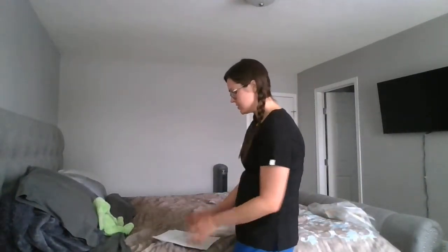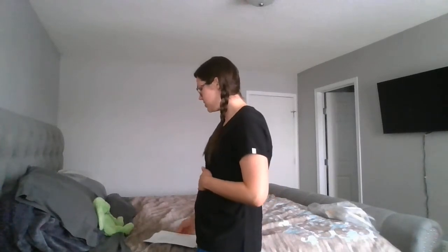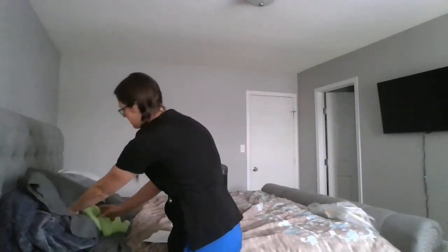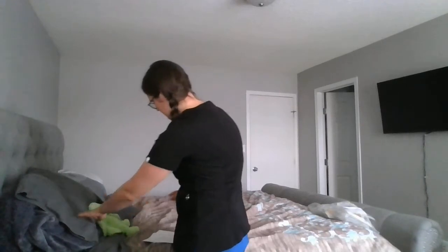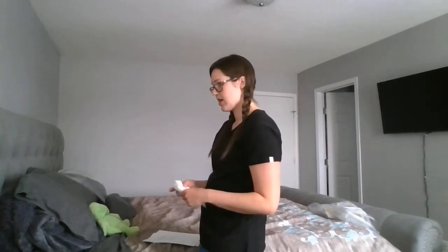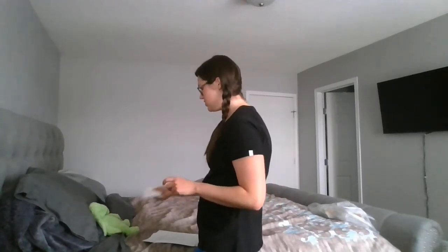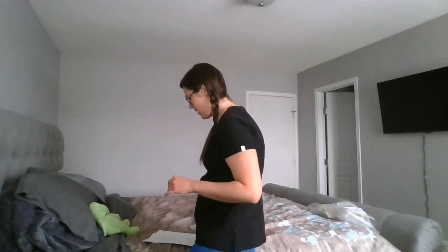So first things first, we'll put our rails down, bed at a good comfortable position. For me, we're just going to have the patient at maybe a 75 to 80 degree angle, so just slightly leaning back. We're going to encourage the patient to blow the nose best they can, just so that the spray is not impeded by any sort of mucus and can be absorbed properly through the membrane. So I'll get him to do that. We'll dispose of that properly.